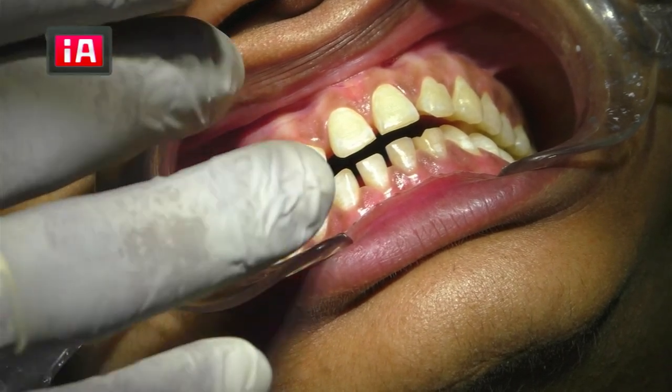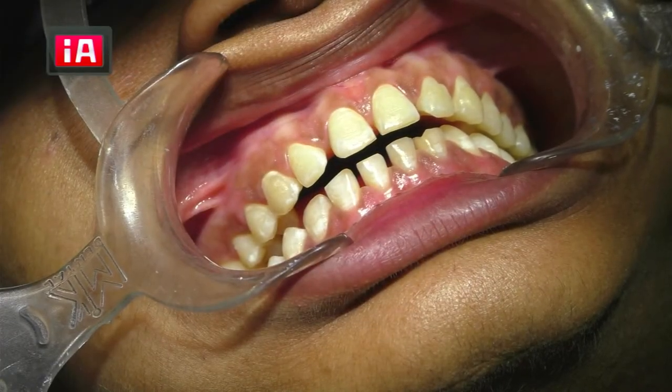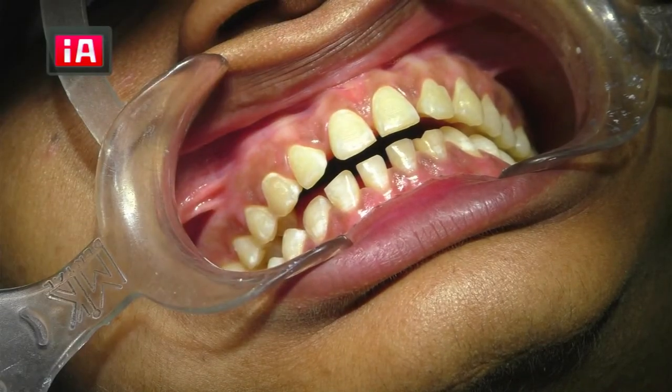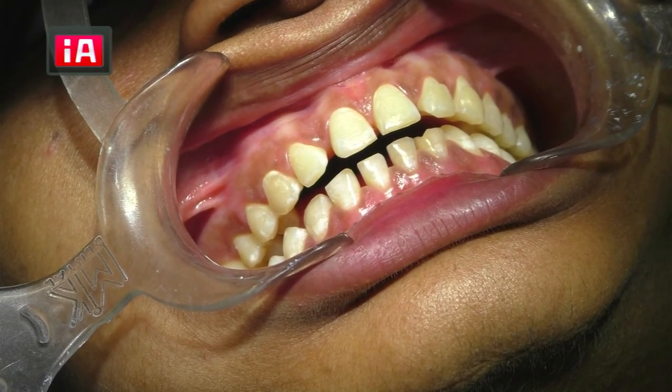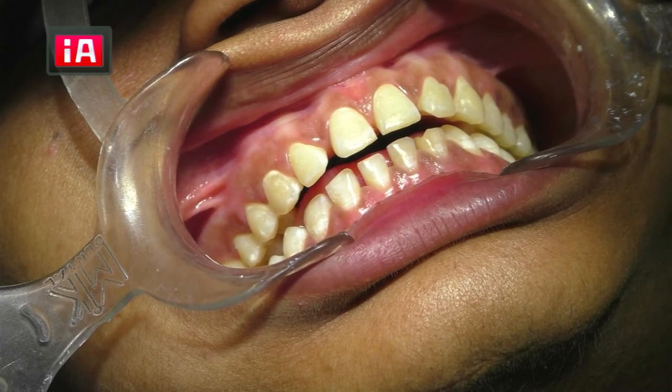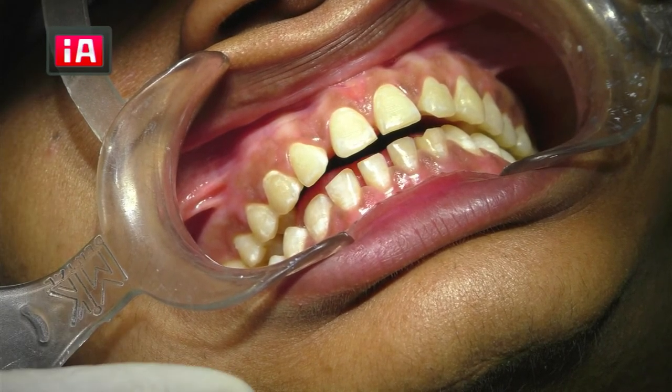It's like this case. She has a nice color, there is not much color difference. We only have to close the spaces, so there we require a laminate. The preparations will be very, very minimal. It is minimally invasive dentistry. We are going to do an almost negligible preparation.